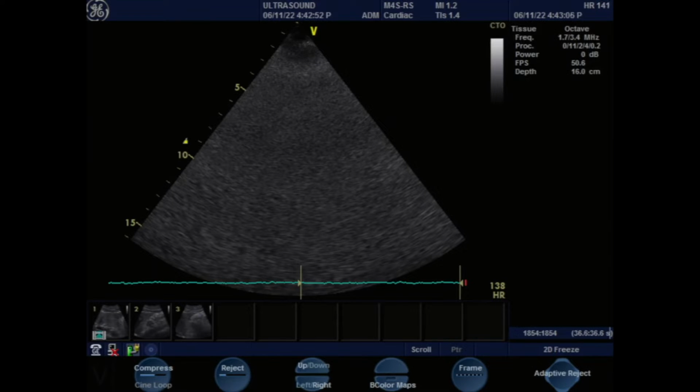But in regular run-of-the-mill heart failure patients, this is left-sided failure. For right-sided failure, if they have pulmonary hypertension, they have right ventricular dysfunction, then the IVC is always going to be large. It's not because they're high in volume, it's because the RV doesn't work.